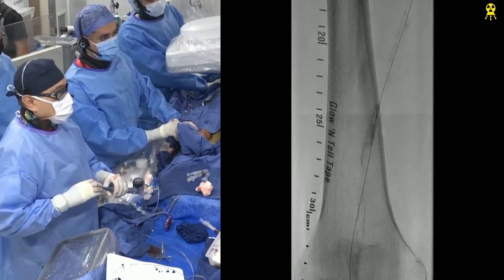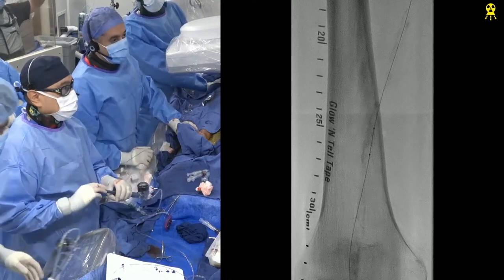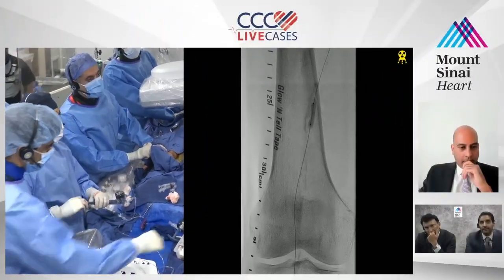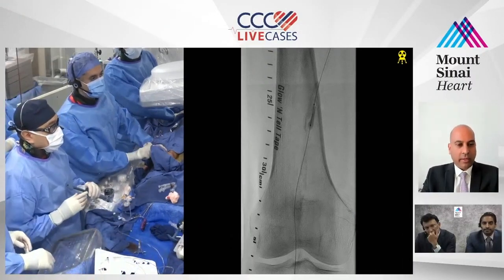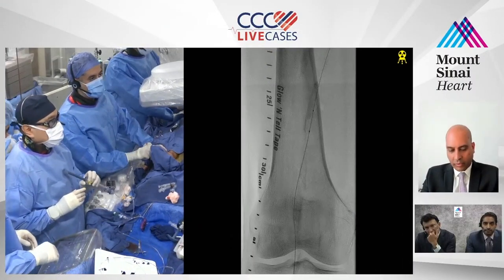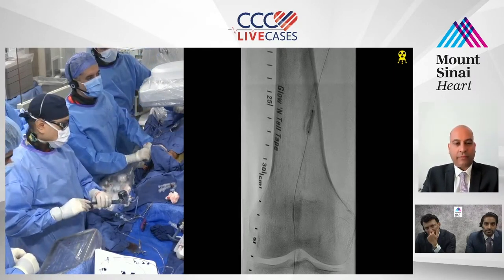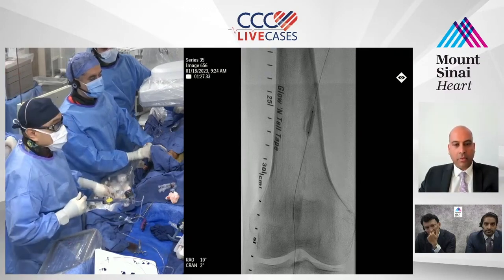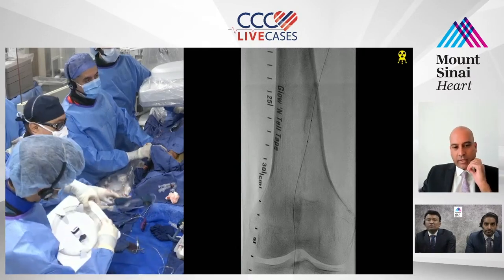All right. So, Srini, what do you think Shockwave is going to add to this? Well, considering how this balloon is inflating, I think if we drink the Shockwave Kool-Aid, as they say, it should get microfractured. That's often why we're going to do Shockwave anyway. Yeah, I didn't want it to go through. Okay. Come down now. So, I think it'll help a little bit.